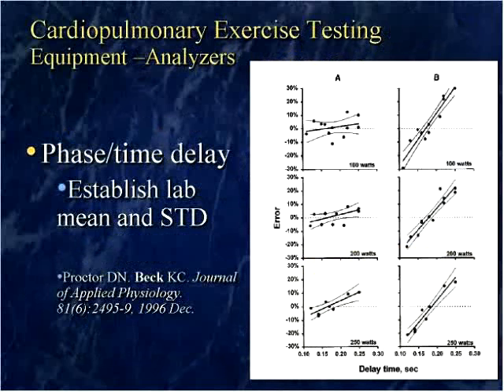functioning accurately. Something that we presented in the literature back in 1996 was looking at the phase or time delay and the effect that it can have on the measurement of your oxygen consumption. And in this particular paper that came out of our lab, we looked at this. Now the phase delay is either the oxygen analyzer phase delay or time delay, or the response time of the analyzer, and or the response time of the CO2. And you need to look at both of those.